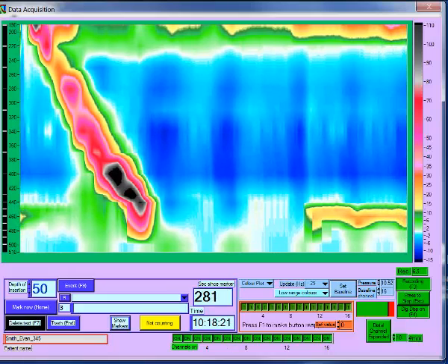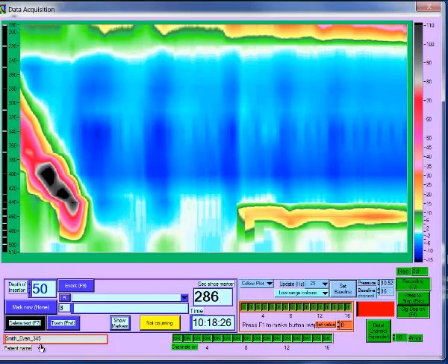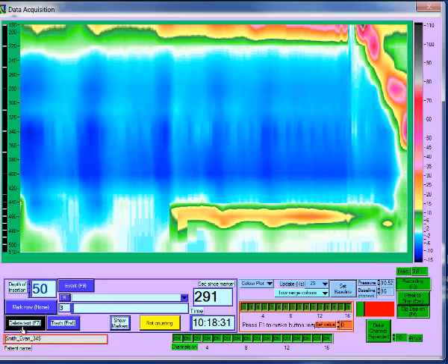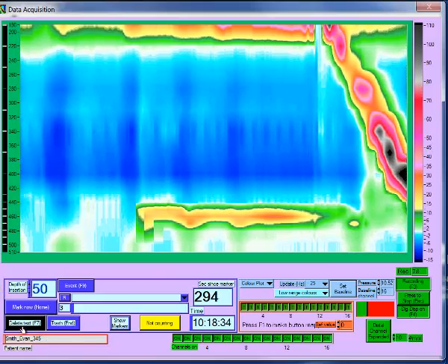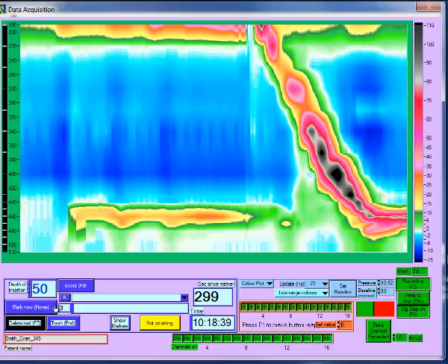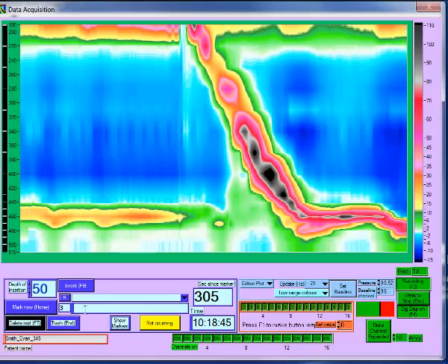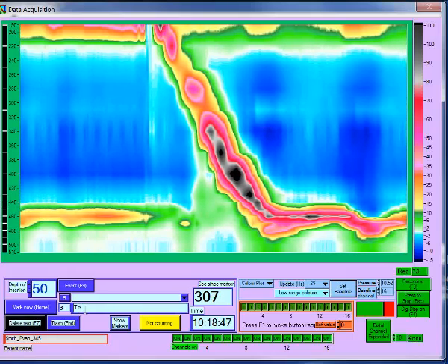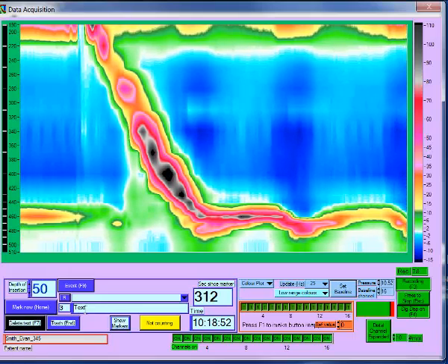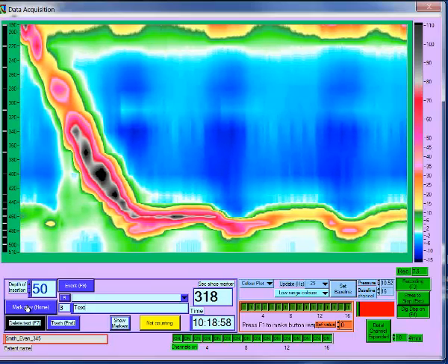The name and ID number of the patient from whom the data is being recorded is displayed in the bottom left-hand corner of the screen. Above this, the dark blue box contains the marker controls and the depth of insertion. The marker controls allow you to enter markers to aid in analysis. The marker text box can have text entered manually. Press on Mark Now to save that text as a marker.